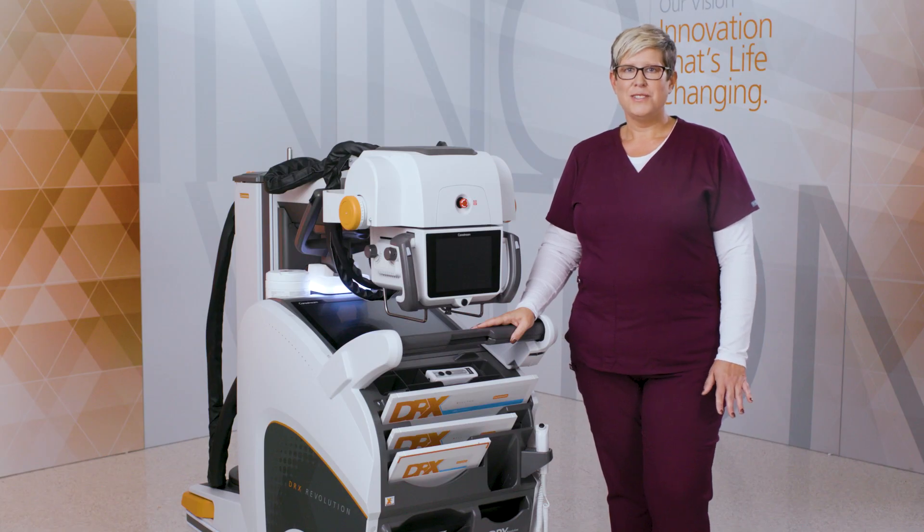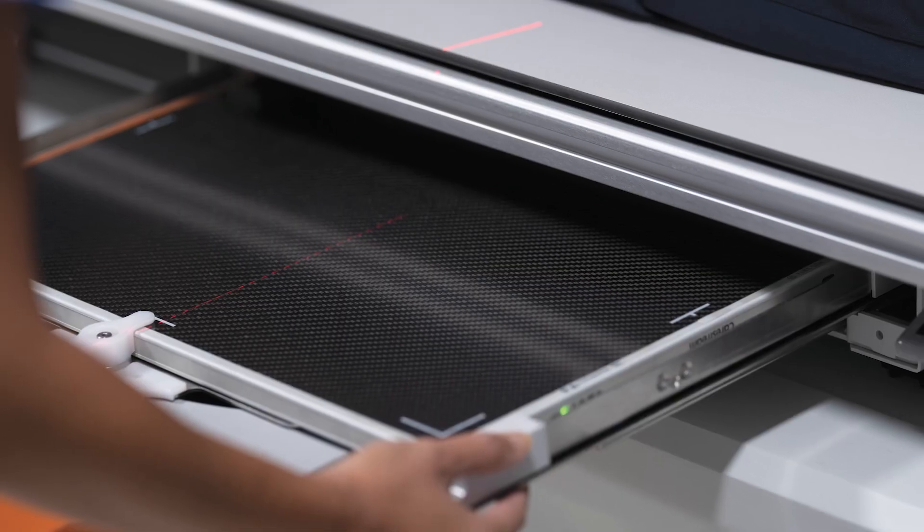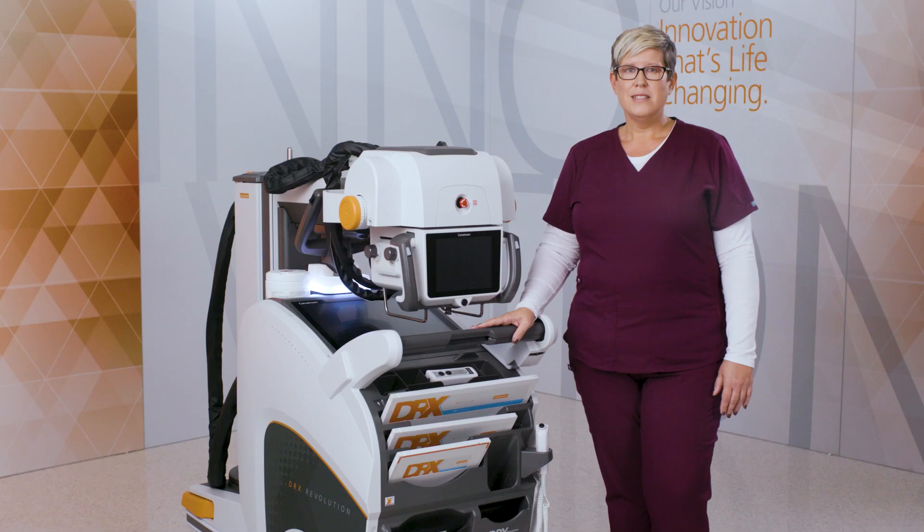DRX Plus detectors are our most robust and durable line of detectors. They can be used wirelessly, with a tether, or fixed within a table bucky or wall stand. They come in a variety of sizes and are available in both cesium iodide and gadolinium scintillators. Cesium improves image quality and offers lower dose, while gadolinium is more budget-friendly.